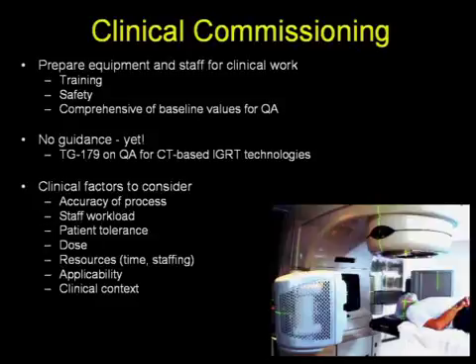Another factor to consider is the applicability of IGRT for the clinical process. Again, for SBRT, where we have high doses and very few fractions and very tight margins, IGRT would be quite applicable, whereas for palliation with wide margins and clinical markups, IGRT might not be so stringent, although it can be used to yield some important and interesting information.